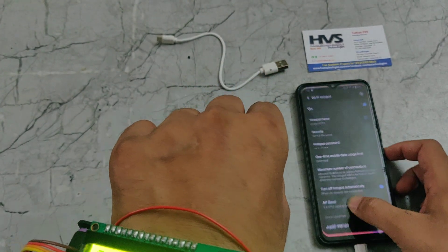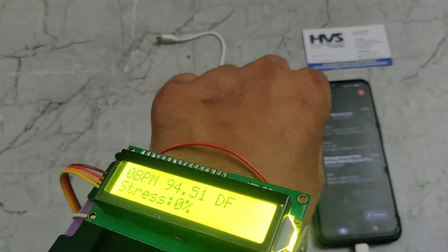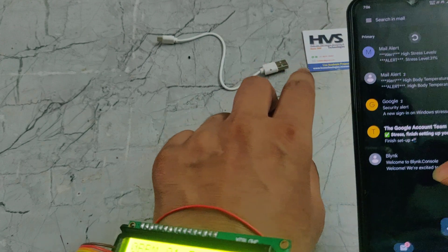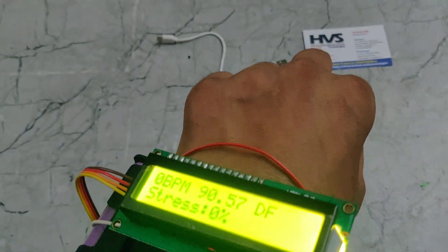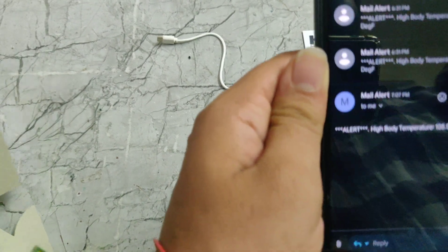Coming to the email, here we can see there is one alert. It is showing that there is a high body temperature alert. This is the previous message from when we were testing.